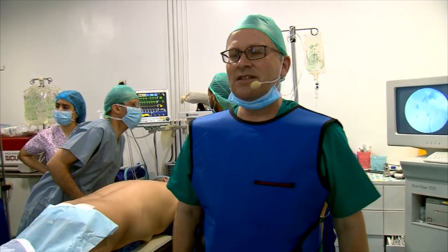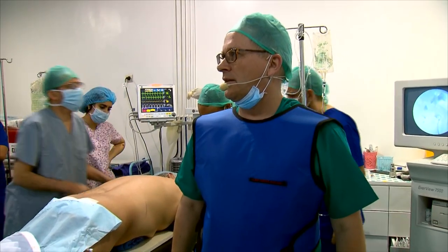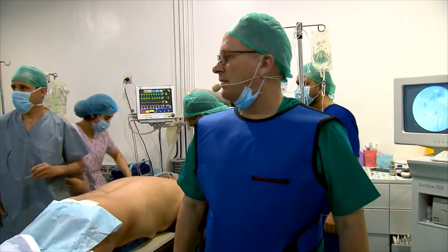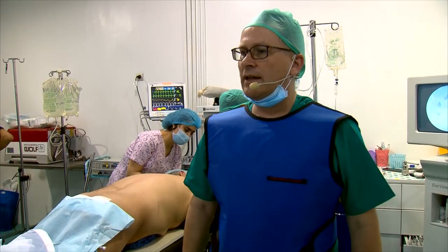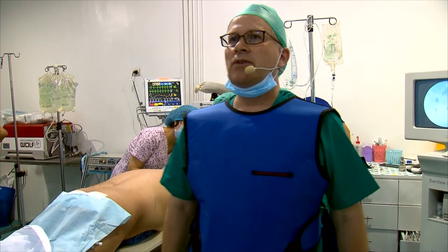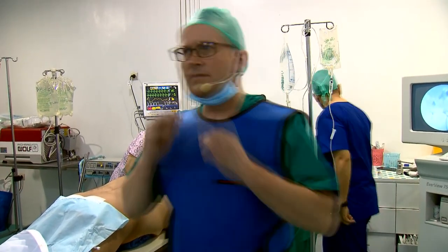Yes, this is of course very important, but this can be determined only by ultrasound. We need another 5 to 10 minutes, and then we check the situation by ultrasound, and then we can decide which is the posterior calyx. Okay, it's good.